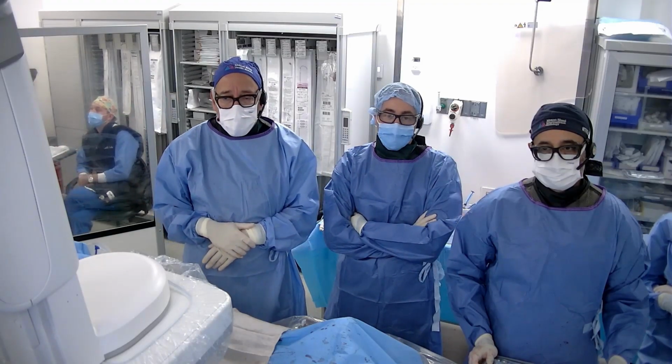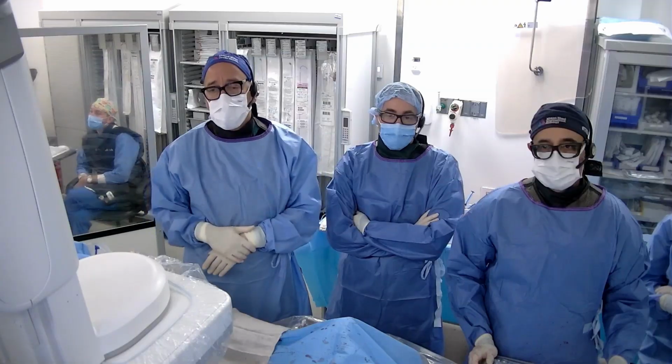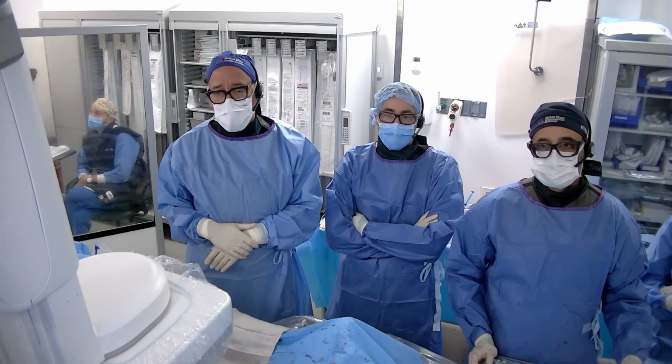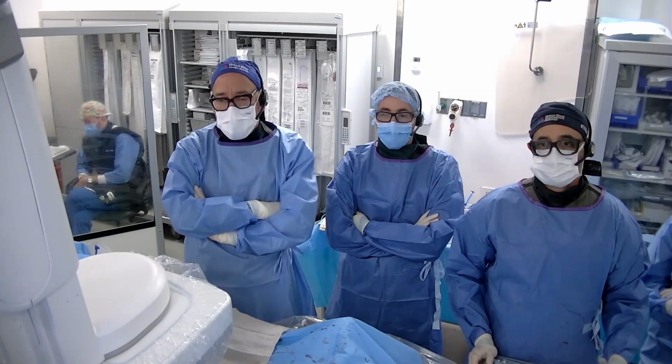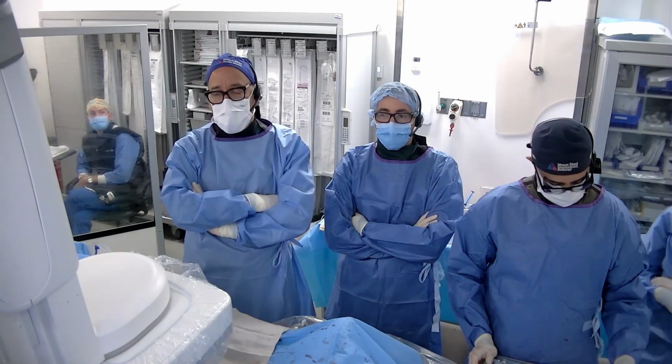Rob, could you just really quickly comment? You mentioned a CT scan. We didn't see it. The angiogram is suggestive of calcium. Was the CT pretty heavily calcified, or is this mixed morphology? I would say it's more mixed. It is not dense. We'll go through the angiogram in just a minute.